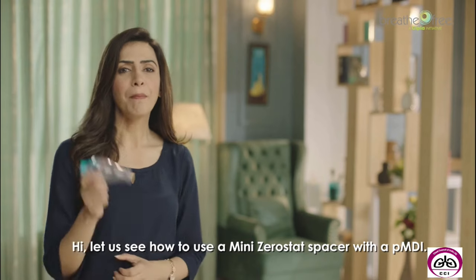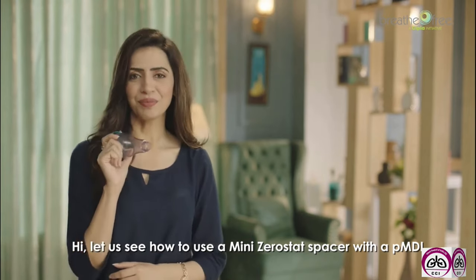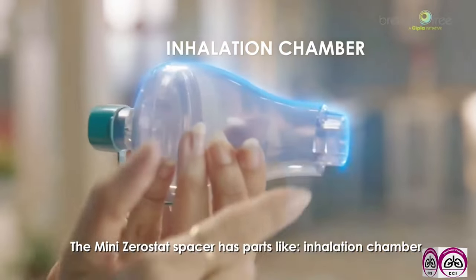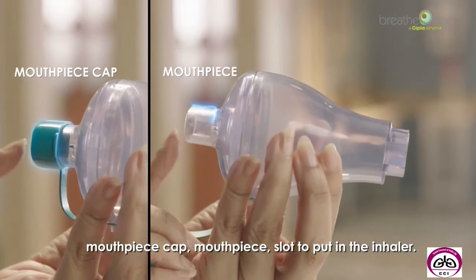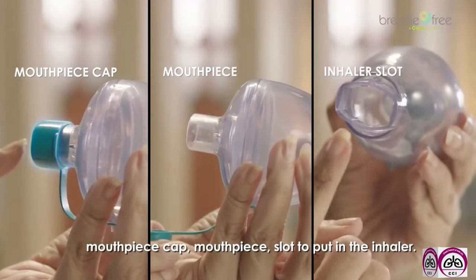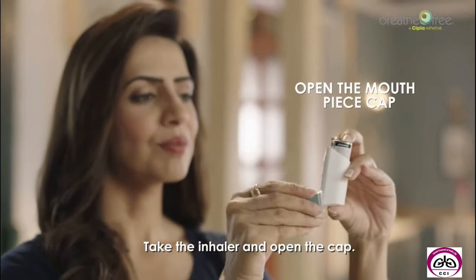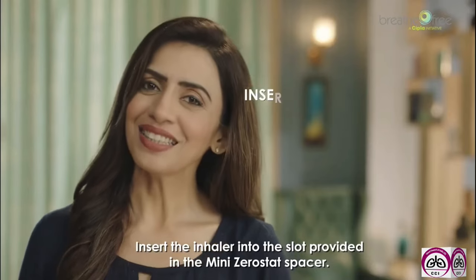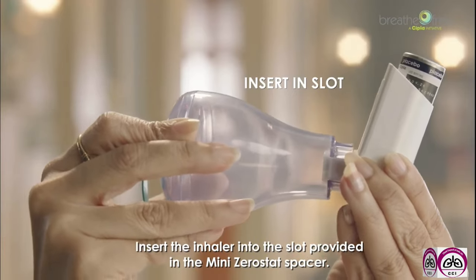Let's see how to use a mini Zerostat spacer with a pressurized metered dose inhaler. The mini Zerostat spacer has parts like an inhalation chamber, mouthpiece cap, mouthpiece, and a slot to put in the inhaler. Take your inhaler and open the mouthpiece cap. Give the inhaler a good shake. Insert the inhaler into the slot provided in the mini Zerostat spacer.